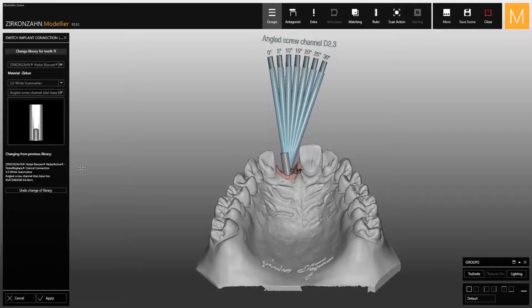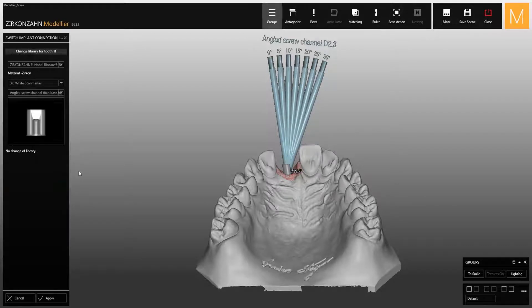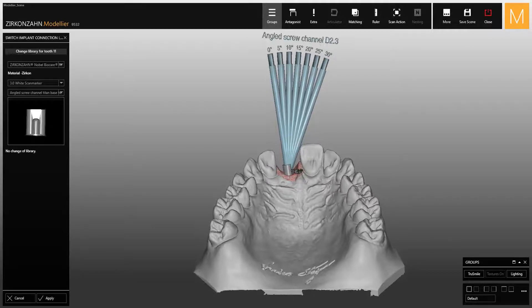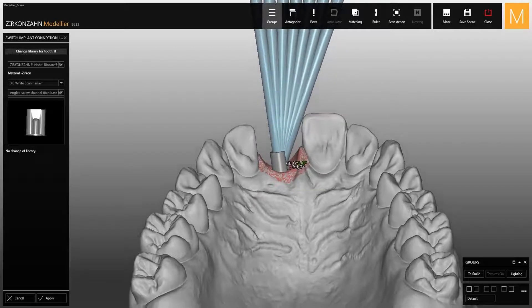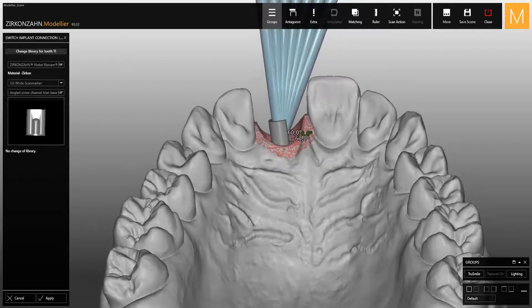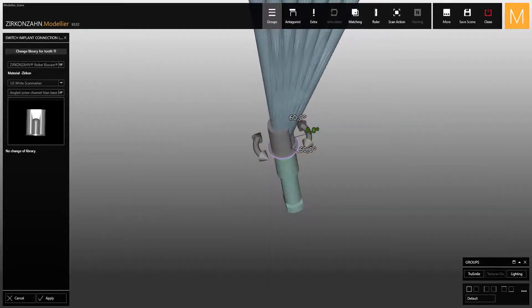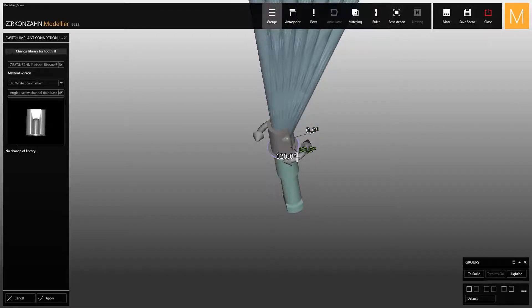If you want to undo your changes and go back, press the highlighted button. In the preview window of the titanium base you can rotate the object and view all its sides. An interesting function is the possibility to rotate the implant components using these arrows. The base cannot be rotated freely; the software indicates for each component the degrees of rotation available, depending on the type of implant connection.